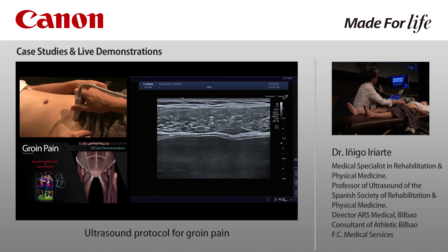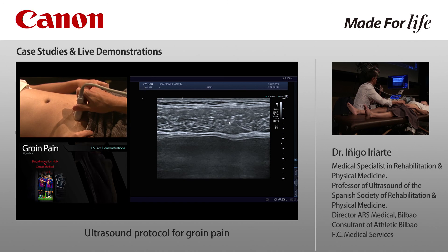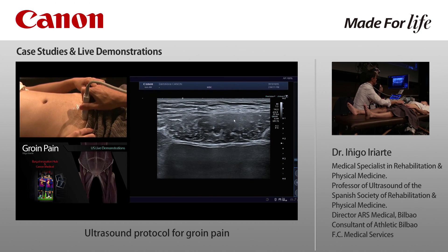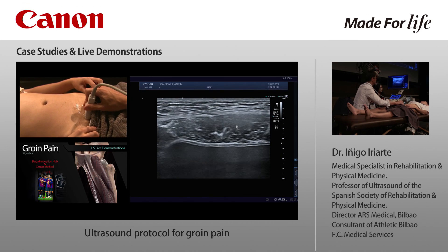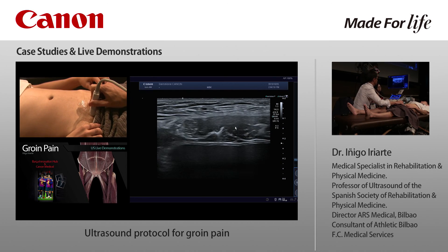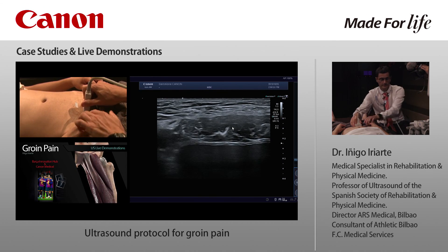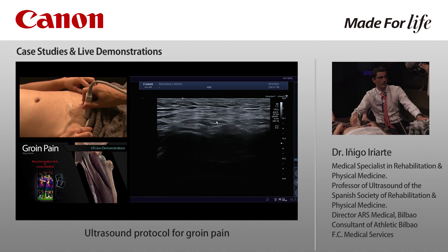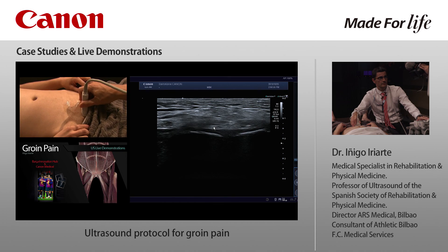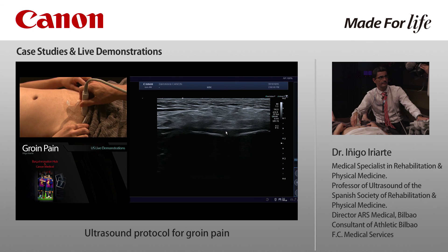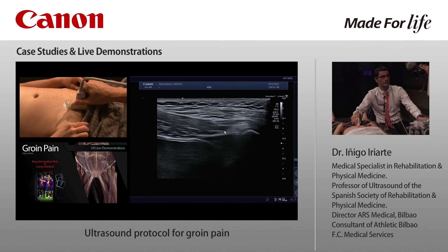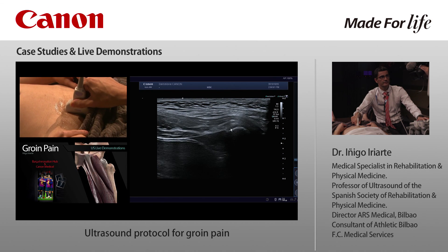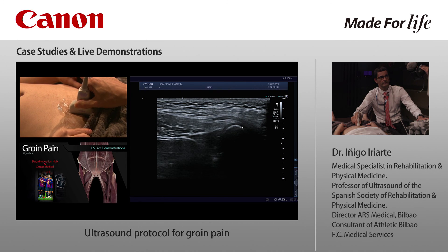These two muscles are the rectus abdominis — this is the left one and this is the right one. As we go distal, we notice a small muscle appearing here — these are the pyramidalis, left and right. Going distal, the pubic bone appears, and this is the insertion of the rectus abdominis in the superior side of the pubis — this is the superior ligament. If we turn the probe 90 degrees, this is the rectus abdominis, this is the pyramidalis muscle, and the insertion of the rectus abdominis in the superior area of the pubic bone.